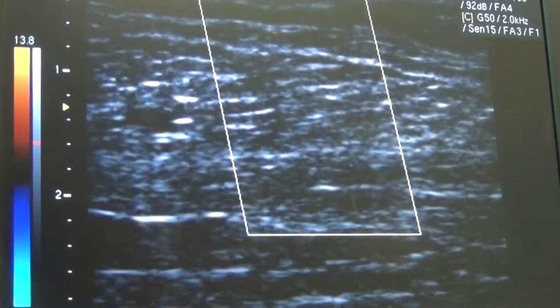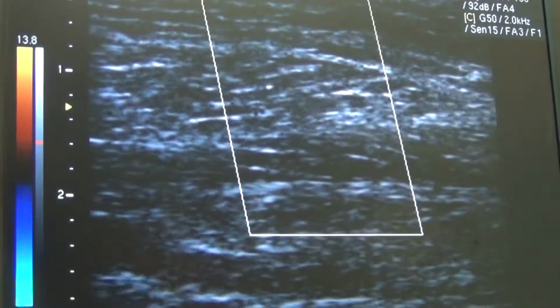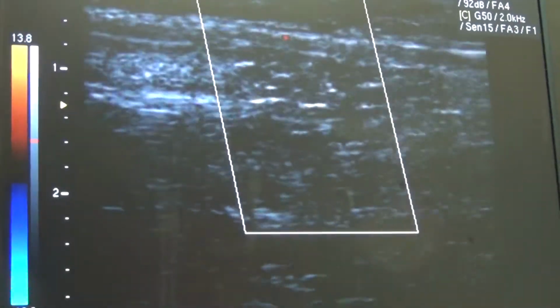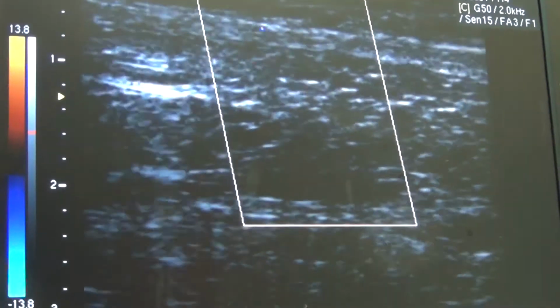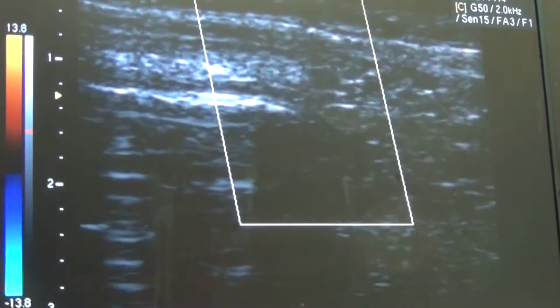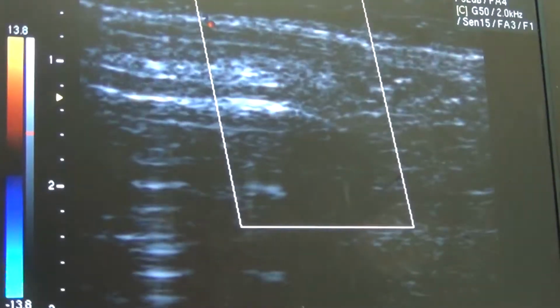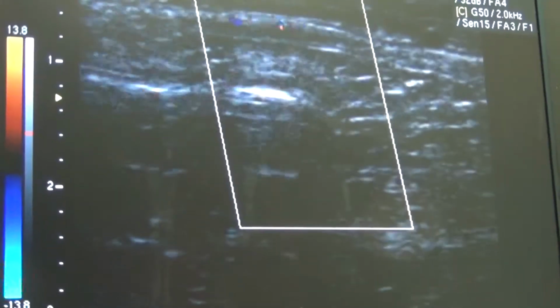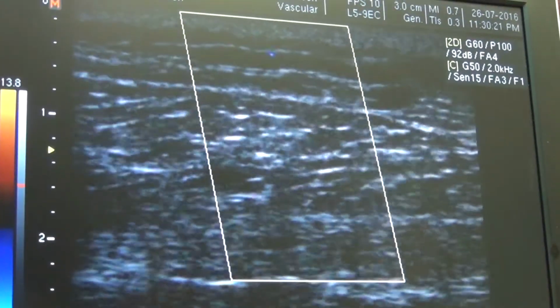The foam sclerotherapy will cause immediate vasoconstriction, produce a thrombus inside the great saphenous vein. We're specifically avoiding the use of endovascular laser here, since the association of thermal injury next to a pulsating arteriole could actually aggravate, in theory, the fistula.